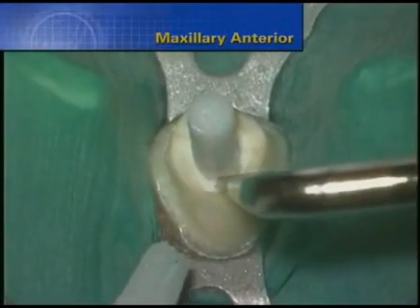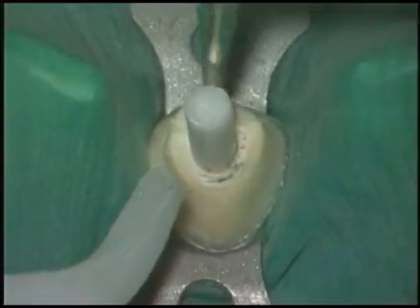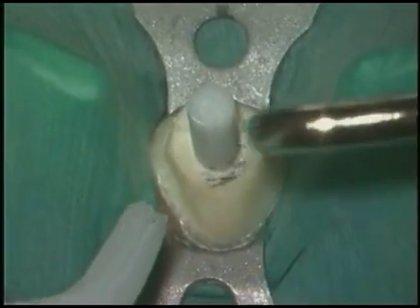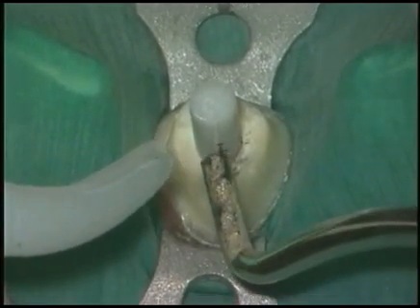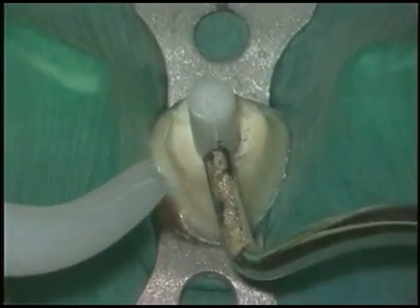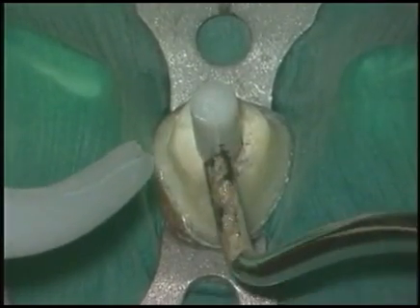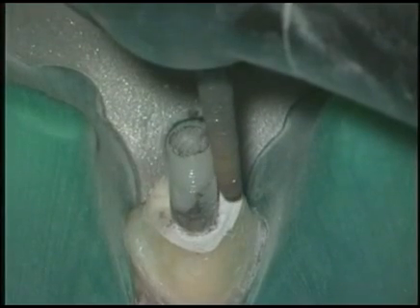Here is a maxillary central incisor with a large fiber post. Specifically, this is a Serra post distributed by Brasler. Ultrasonics is not that successful typically to remove these posts because in the advent of aesthetic dentistry and adhesion dentistry, these posts are substantially more secure in their roots than their metal post counterparts.